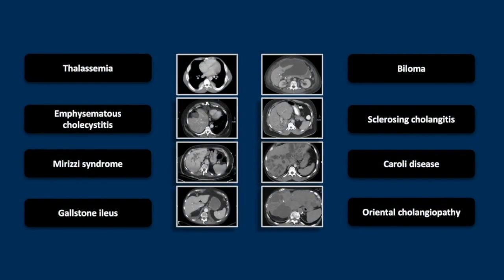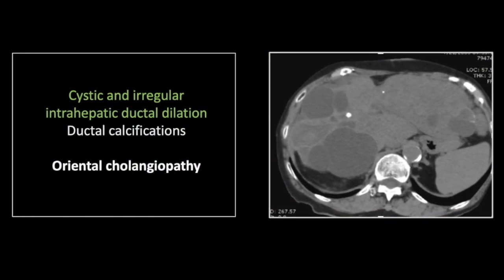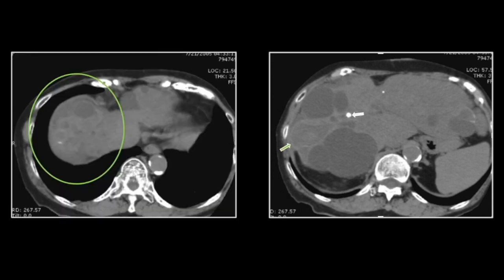Our next case is an unusual infection — oriental cholangiopathy. There are multiple dilated tubular and cystic structures throughout the liver. You can track most of these dilated hypodense structures back to a communication with the biliary system. In addition, there are numerous biliary calcifications throughout the liver — a telltale finding of clonorchis infestation and oriental cholangiopathy.